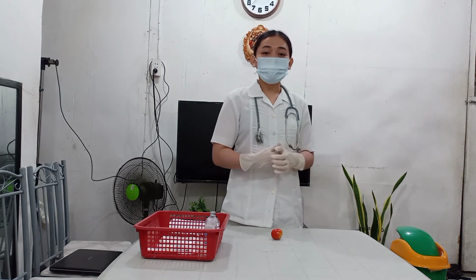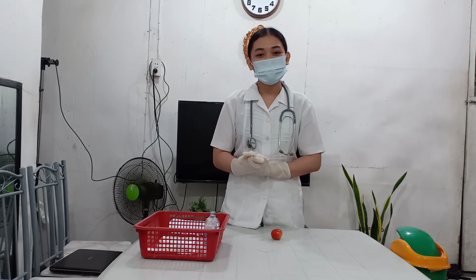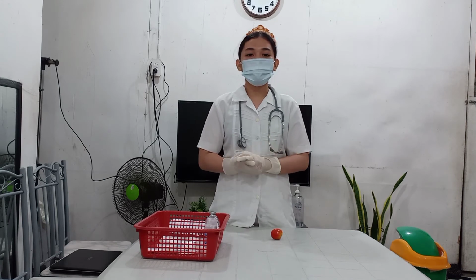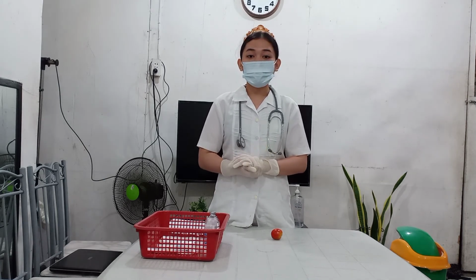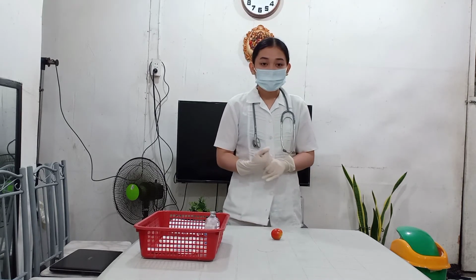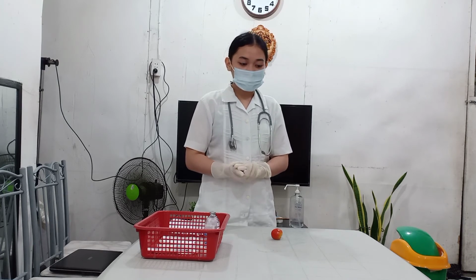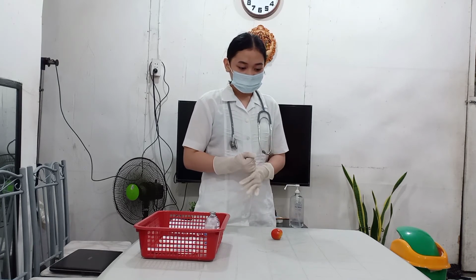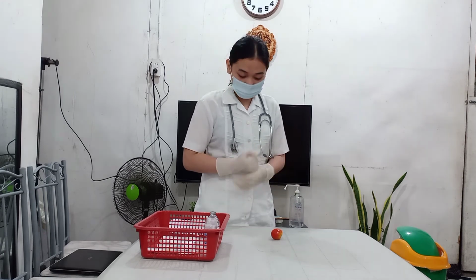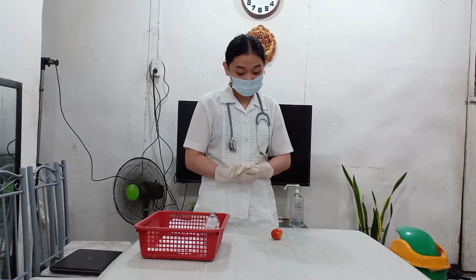Next is we explain the purpose of the medication, including relevant information about the effects of the medication. Explaining rationale increases the patient's knowledge and reduces their anxiety. So, okay, Mr. Tomato, today I am going to inject via your deltoid side and intramuscularly to give vaccination to strengthen your immune system. Is that okay with you, sir?